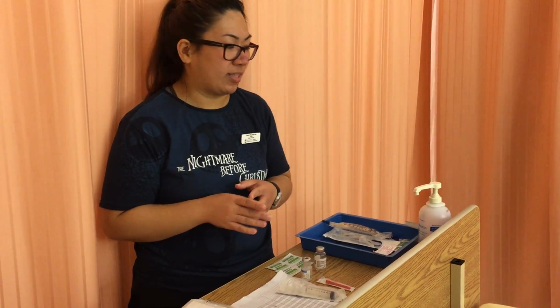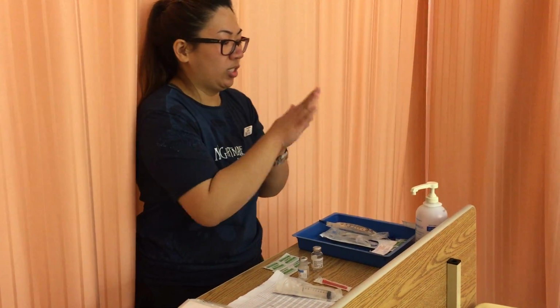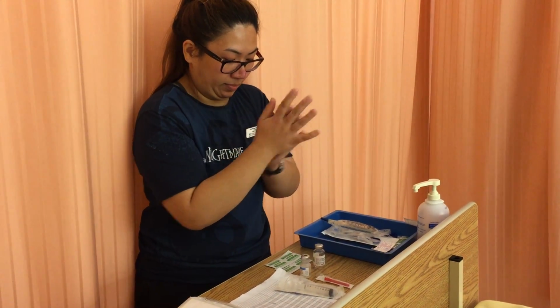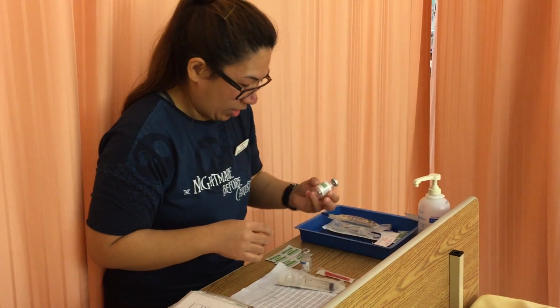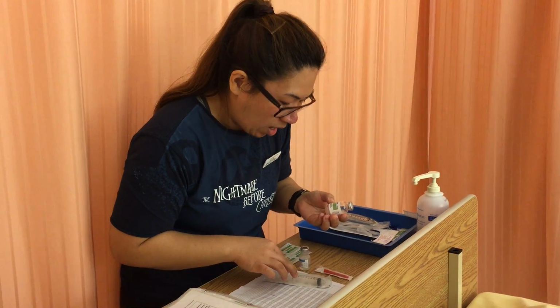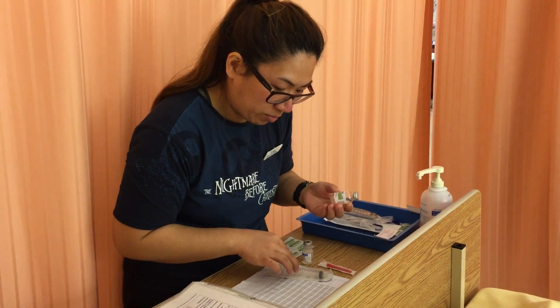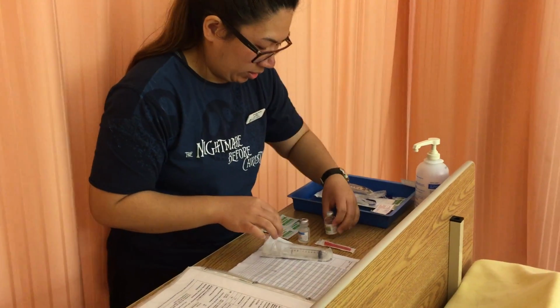Now, before dilution, I would also do my second check at this time. Hand hygiene, give aseptic technique. So cefoxitin 750 mg IV at 1400 now for Mr. Anthony Medina. That's right.